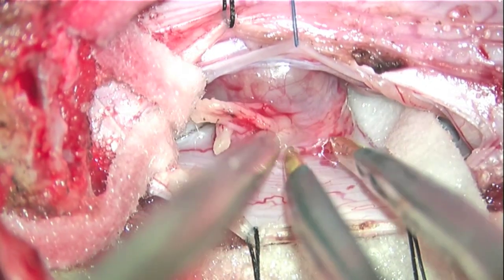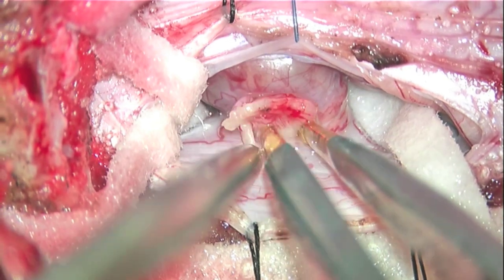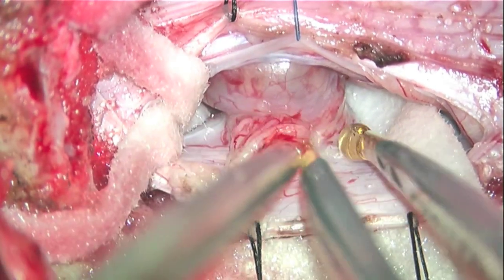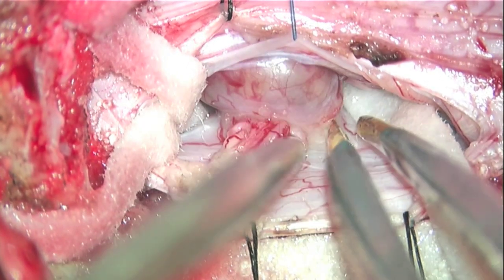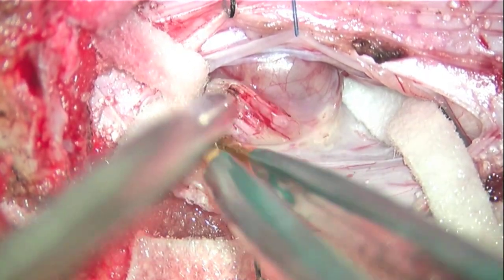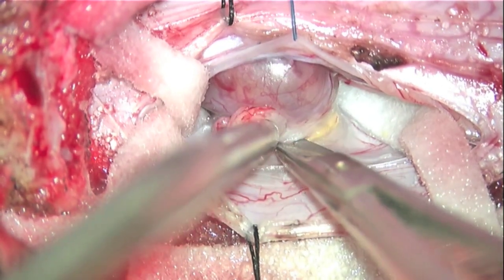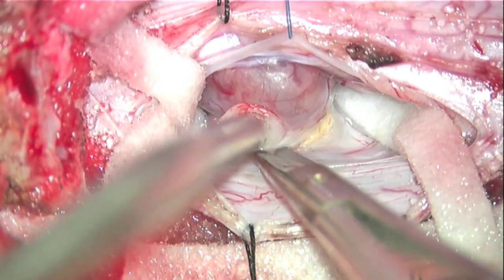In this case, since I can't see the afferent nerve of origin, the dissection is begun laterally to devascularize, shrink, and detach the tumor at the root entry sleeve. This is achieved with irrigating cautery and both blunt and sharp dissection. Ultimately, the intradural tumor component will be detached laterally at the entrance to the nerve root sleeve.